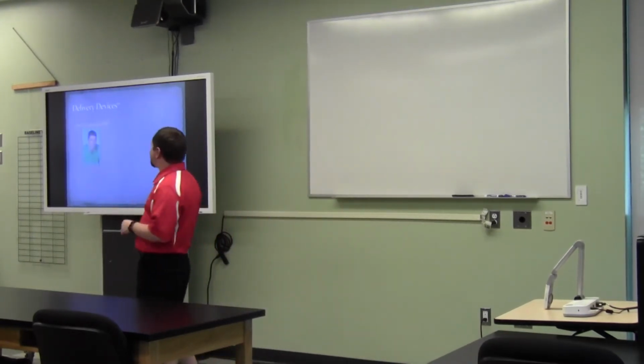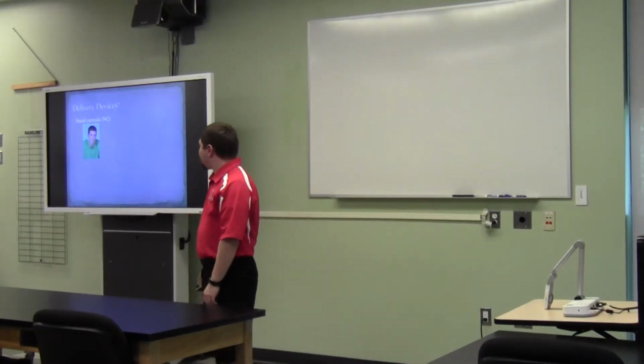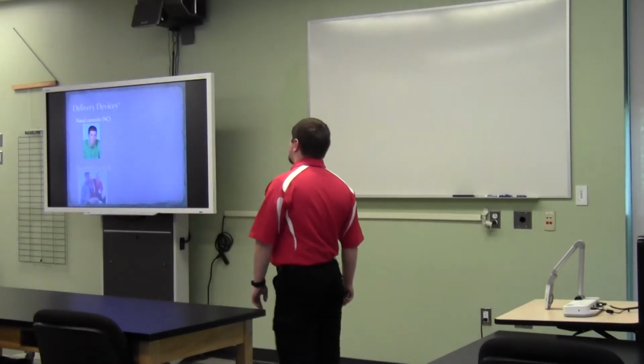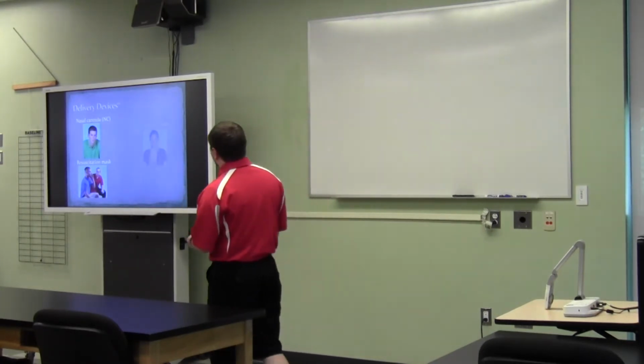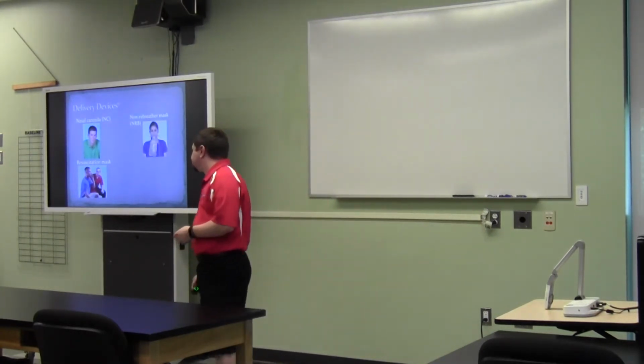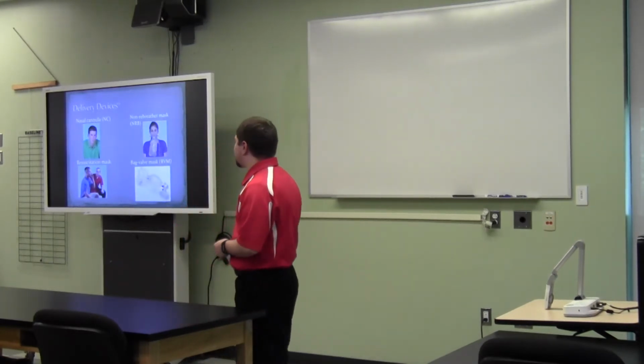All right, so delivery devices. Okay, we have basically 4 ways we can give oxygen to our patients. So we got the nasal cannula, okay, the resuscitation mask or the pocket mask, the non-rebreather, and our ever famous bag valve mask. Okay, so 4 ways we can give oxygen.